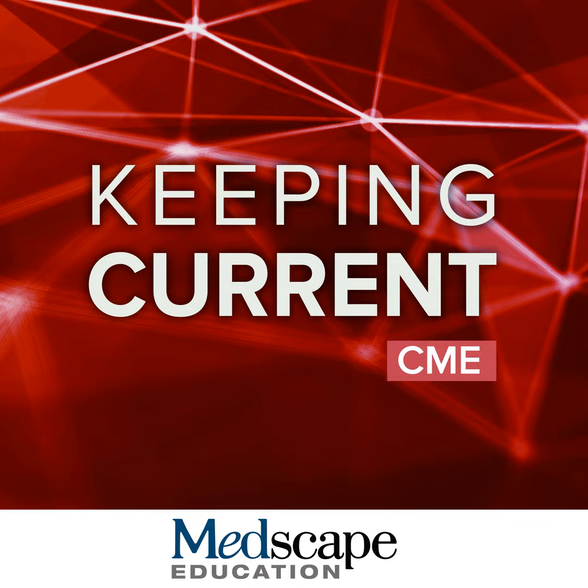And I think you can sort of think of this the same way, which is if the CSF was performed and it had a clear result, then it's probably not appropriate to get that amyloid PET scan. But if there's something about that CSF that was inconclusive or equivocal, then an amyloid PET scan can be very, very helpful and may determine the next course of therapy that the patient gets.